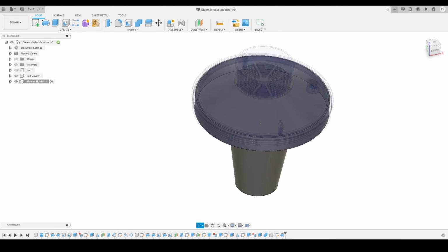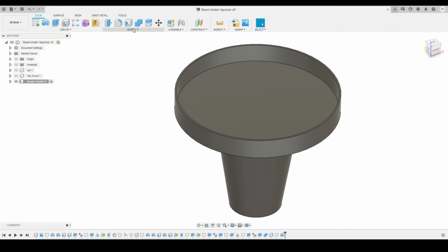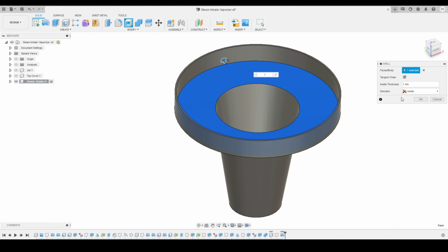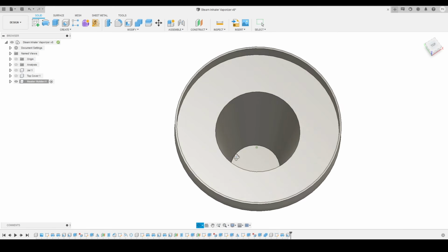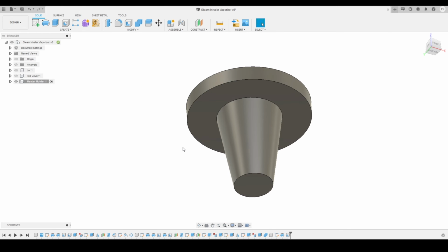So I will just turn off the top cover to show you better. Here you can see I will activate the shell tool. I will apply a shell thickness of 1 mm on this face. So after applying shell, here you can see this is the result we got, and this is what we had made so far. So now what I will do, I will just turn on the top cover.